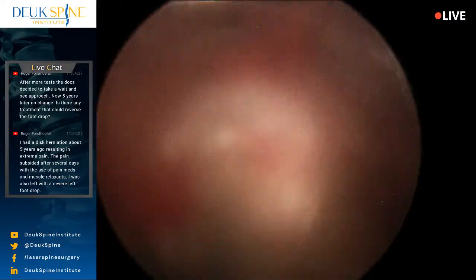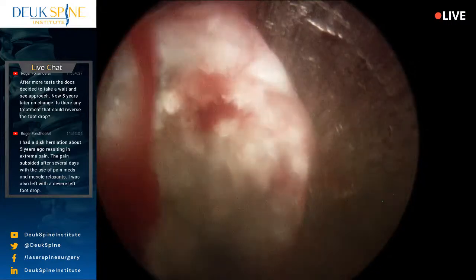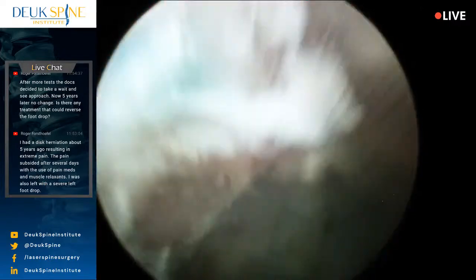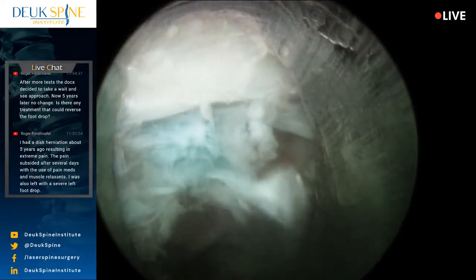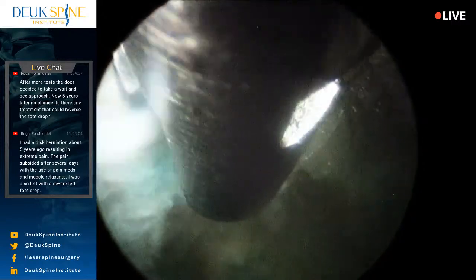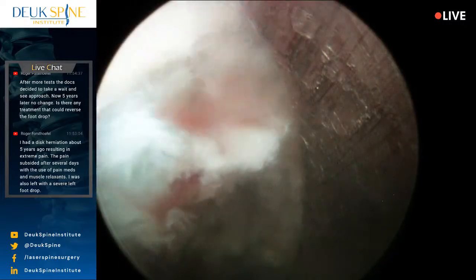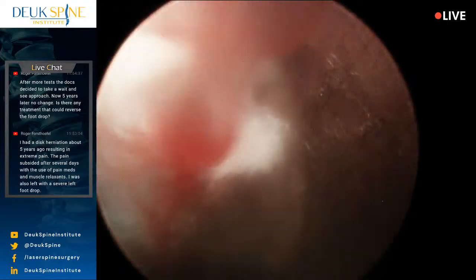All right, let me just bring the grabber one more time. I'm going to bring the grabber because it helps stop the flow and it allows me to see things better. Okay, there's the epidural space. The nerve root is right there. You see that white thing? I could probably get that little bit right there that's left. It's not really causing a problem, but I don't want it to. I'll use the laser to do that. But pretty much the nerve is decompressed.